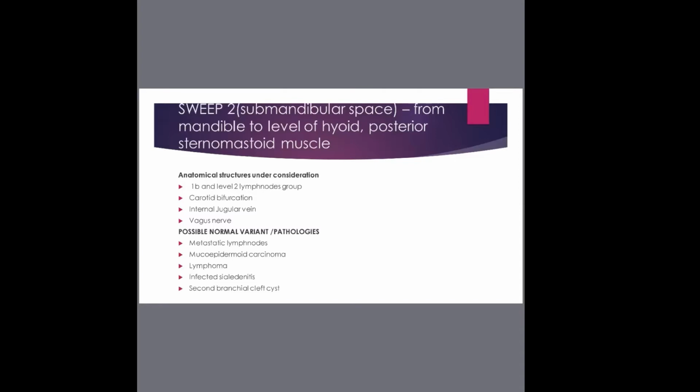So, mucous retention cysts, sebaceous cysts, oropharyngeal primary lesions. Now, why I need to point out something here. There was a day I was scanning. That patient didn't come for anything that has to do with the tongue. The patient came because there was a swelling at the back, and that swelling at the back was a lipoma. But because I'm used to doing the sweeping, because it is important to do those sweeps, in the process, I found out that there was a tongue lesion.